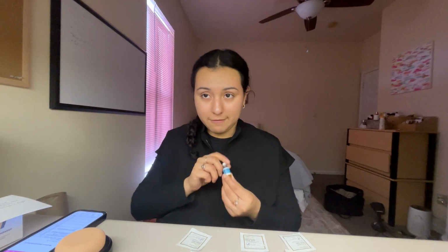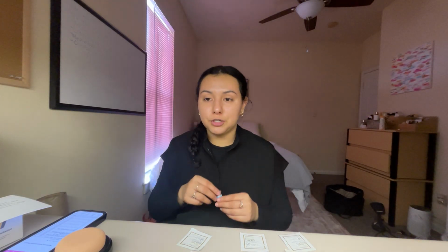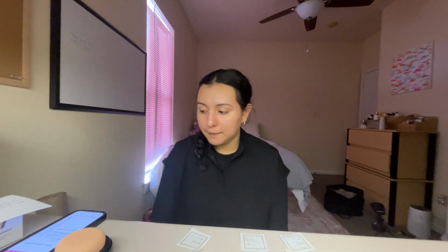And then I have Demerol, 12.5 milligrams. So I have 25 milligrams, and I need to convert it to milliliters. So 25 milligrams equals 1 milliliter for my syringe. So I'm going to need half of it, so I'm going to withdraw 0.5 milliliters. Okay, so my MAR check number 1 is complete.